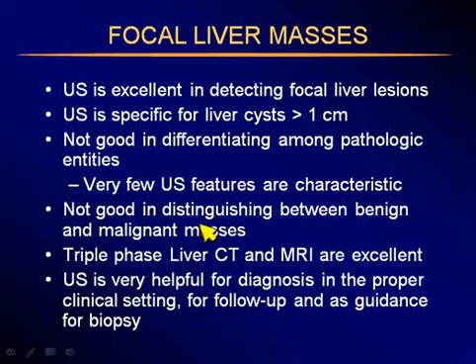We are not good in distinguishing between benign and malignant masses. Triple phase liver CT and MRI are excellent modalities for this, but we are good for picking up a focal mass, and we are also very helpful in the diagnosis in the proper clinical setting. We're good for follow-up and as a guidance for biopsy.